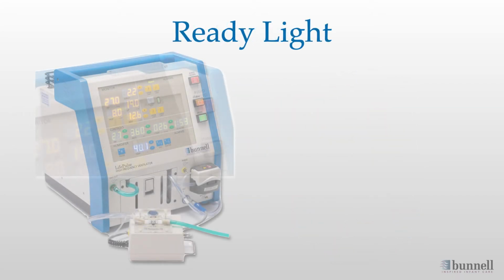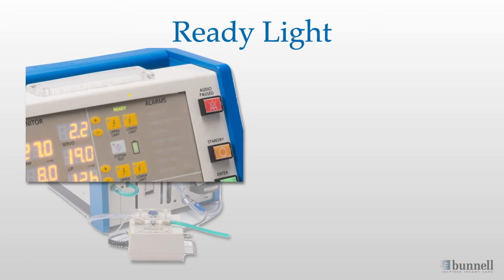The ready light is located in the alarms panel just above the upper and lower servo limit buttons. Once the jet is activated, prior to the ready light being illuminated, the ventilator is in the non-ready condition. During this learning phase, it is in the process of calculating alarms and generally takes 45 to 90 seconds.